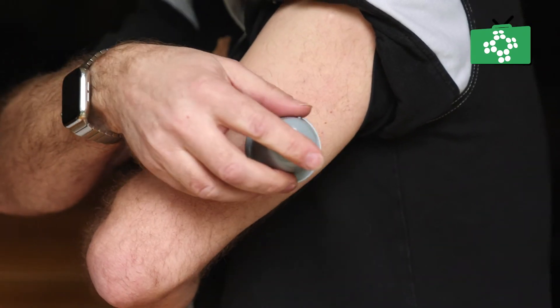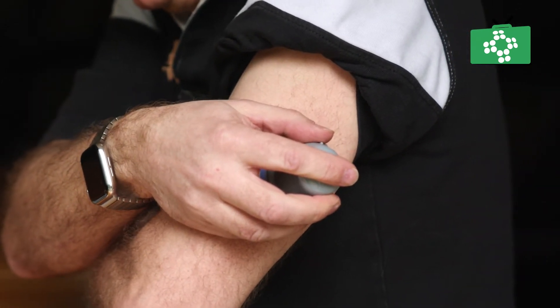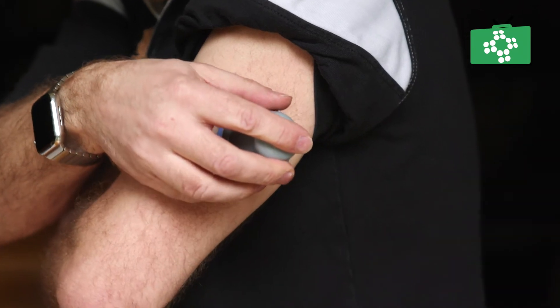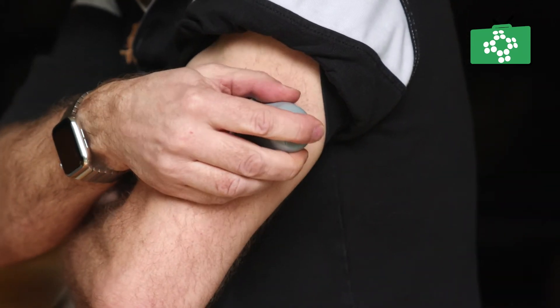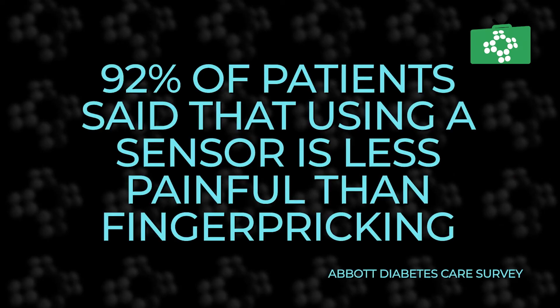The Freestyle Libre 2 sensor is applied to the back of your upper arm with a simple disposable device called an applicator. When the sensor is applied, a thin flexible sterile fibre is inserted just under your skin. In a study conducted by Abbott Diabetes Care, 92% of patients surveyed agreed or strongly agreed that applying the sensor is less painful than finger pricks.